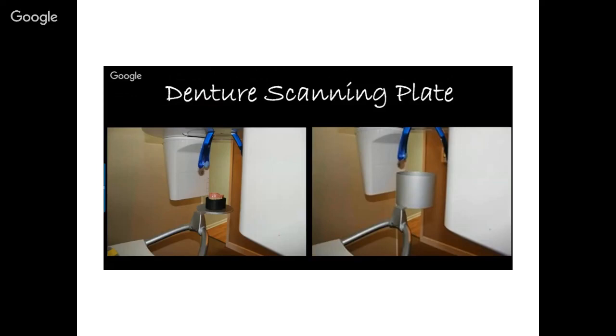Some scanners come with an aluminum can that reduces radiation. You could try different settings and see what results in the best scan. So the denture is scanned on its own, and the patient is scanned as well with the denture and the markers in their mouth.